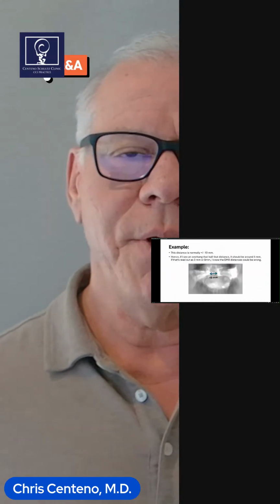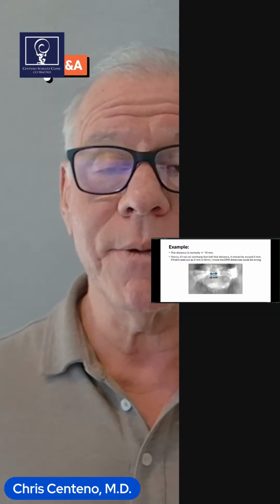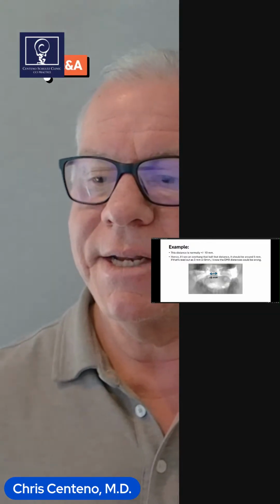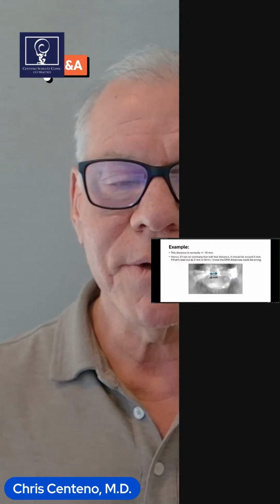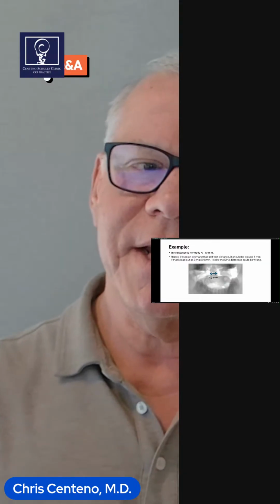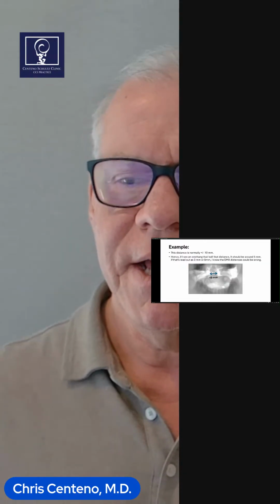So this is an example that I would come up against, I want to say maybe 1 in 5 times when I got a DMX report. I knew that the distance across here, across the dens, was about 10 millimeters, give or take. I think the smallest I've seen it is about 9 millimeters. The biggest I've seen it is about 12 millimeters.